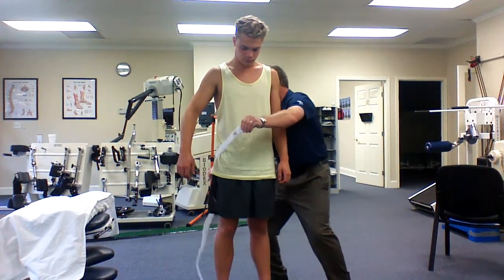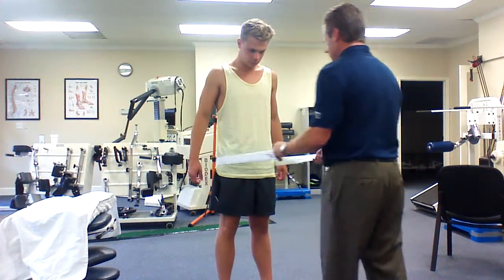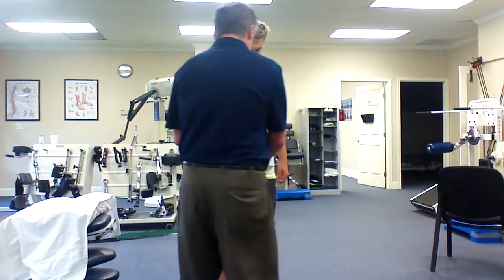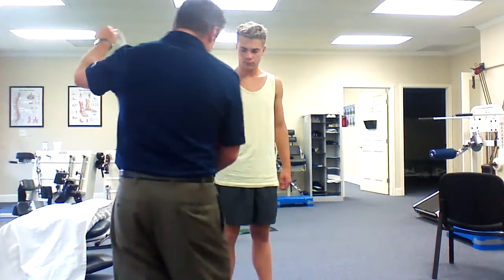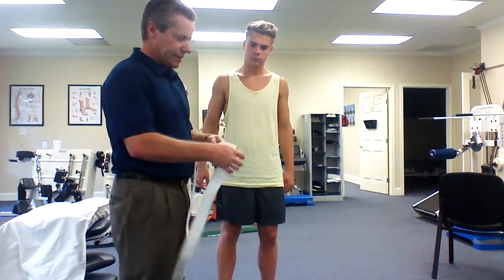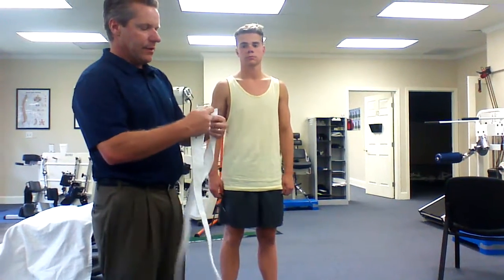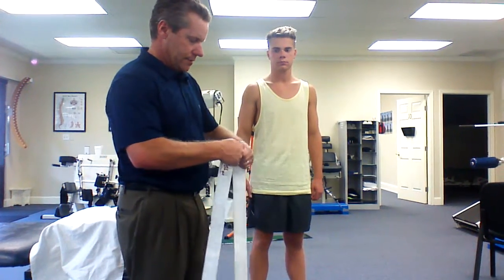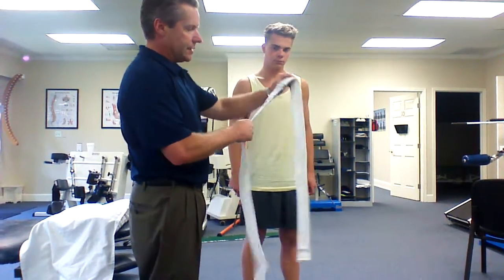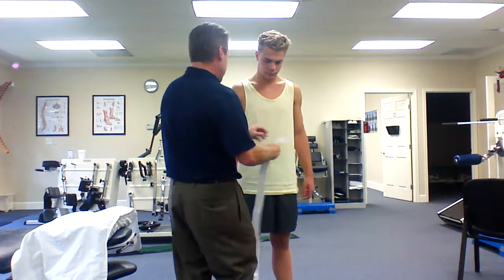This is just for trial, but if you were wearing this through the day, Luke, you would have this underneath your clothes. It's designed to go right against your skin, but my experience has been that when it's right against your skin, it can actually chafe you. One of these was turned around backwards — third time's a charm. All my sticky stuff is where it should be now.